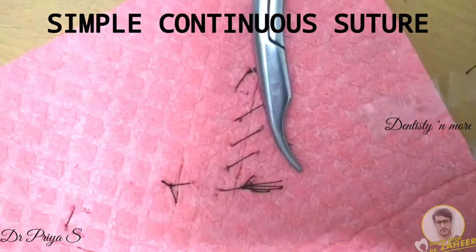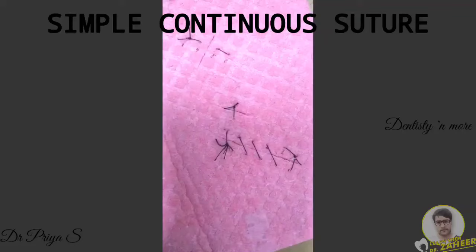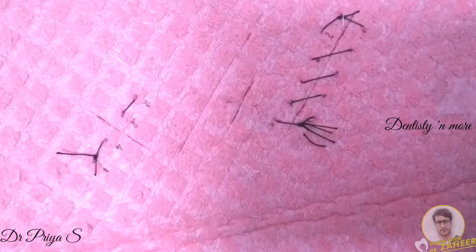So this is how a completed simple continuous suture looks. The advantage of simple continuous suture is that it is quick to make and has fewer knots. The disadvantage is that it is not possible to free just one suture at a time — even if one suture breaks, the whole closure is affected. Moving on to locking continuous suture.